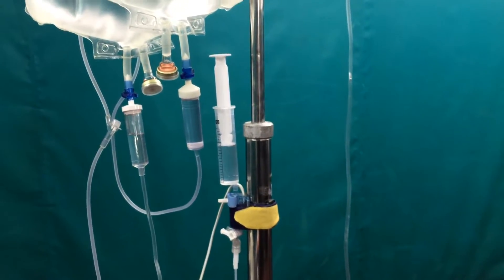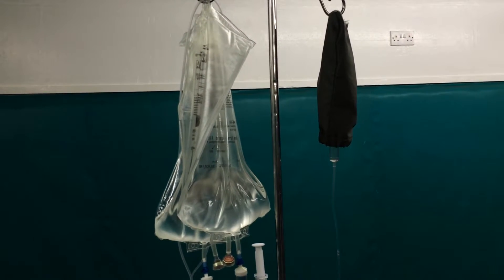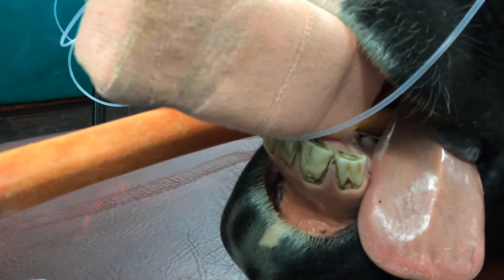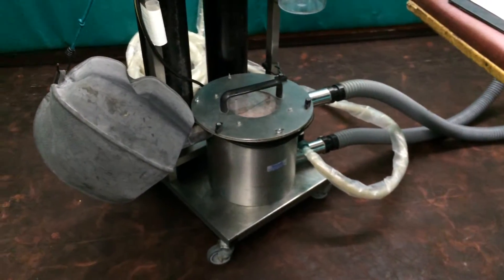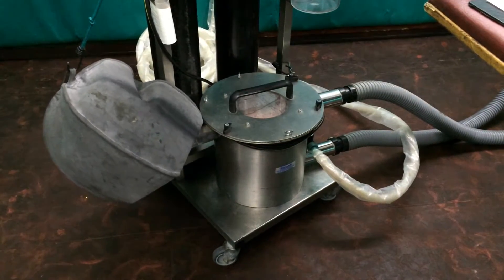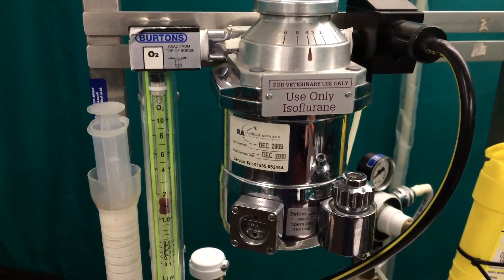We also have on the right hand side, covered up to protect it from light, a bag containing dobutamine which makes the horse's heart pump harder and at high doses even pump faster. We also have an endotracheal tube into the horse's airway, protecting the airway but also delivering a mixture of oxygen and anaesthetic gas which is re-breathed through this bag. You can see it moving in and out as our patient breathes; the carbon dioxide is removed and then the anaesthetic gas and oxygen are added to the system.